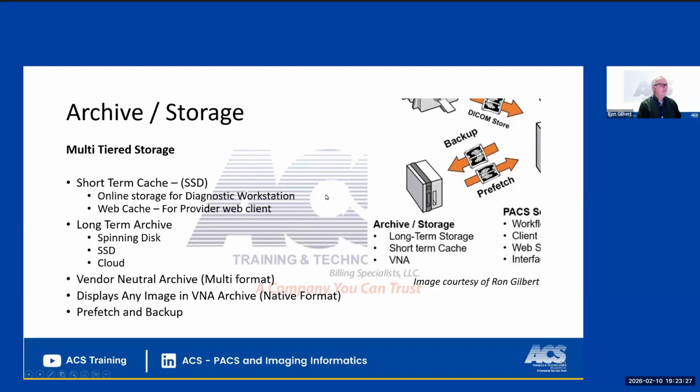And so you have short-term memory, you have long-term storage, and then you also have what formats you're sending in. You may have a vendor-neutral archive, which means you can store images in any format. So if you do an ophthalmology exam, it's your eye, you can store it in there and it's going to keep it in that format. If you store a DICOM image, it'll keep it in DICOM. The whole point here is that if you need to export that to another hospital or for that patient, that image is in the right format for that system to be able to use it.